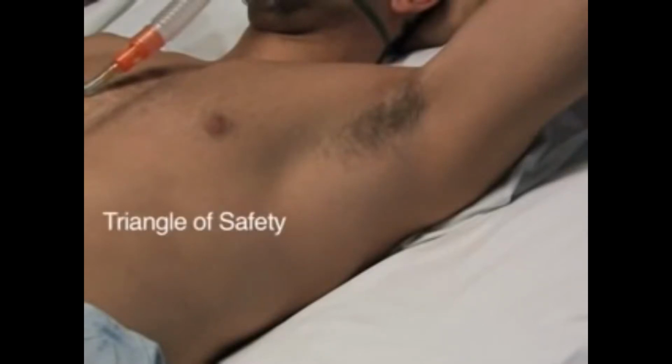The ideal location for the insertion of a chest tube is in the triangle of safety. The anatomical region is defined by the lateral border of the pectoralis major anteriorly, the anterior aspect of the latissimus dorsi muscle posteriorly, and the horizontal level of the nipple inferiorly. The triangle of safety lies between the 4th to 5th intercostal spaces in the anterior axillary line.